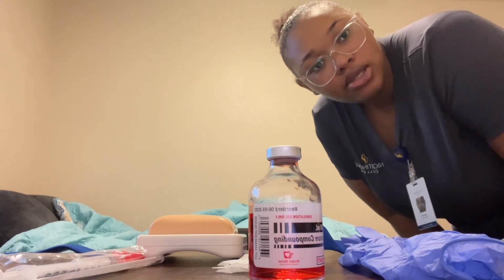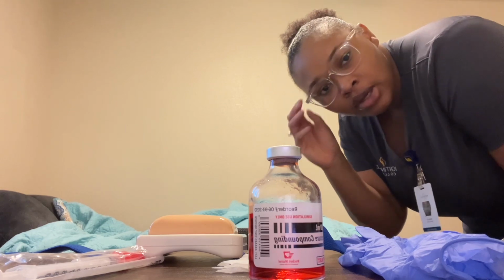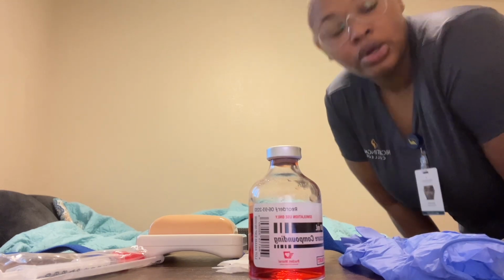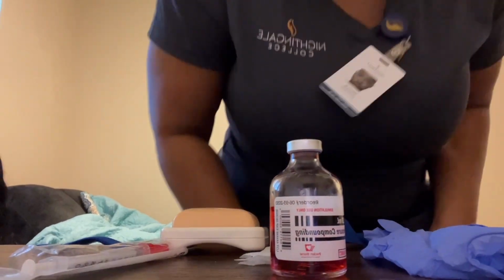Hello, my name is Talisa Ramirez. I'm in the BSN 225. I am doing the intradermal injection video. I have on my badge and correct scrubs. I have my supplies.